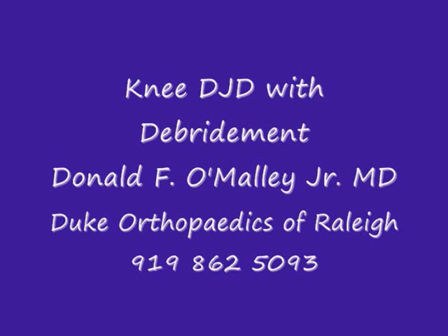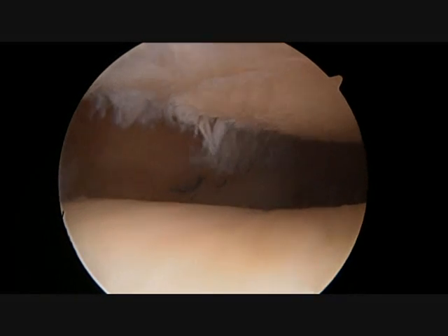Welcome to my instructional video of a knee arthroscopy to visualize arthritis of the knee and to treat the arthritis with debridement.